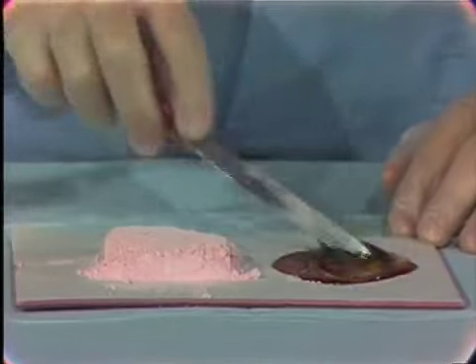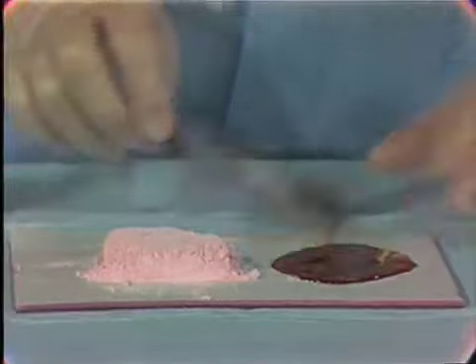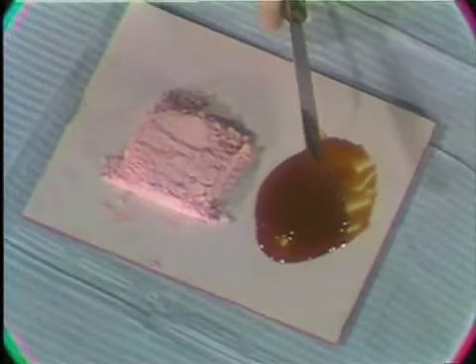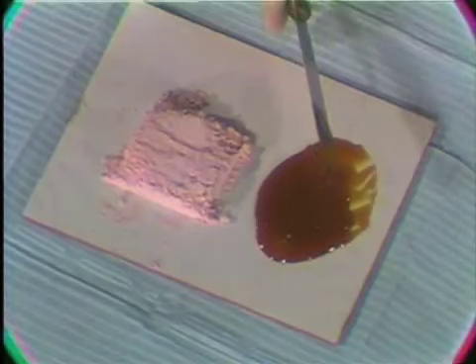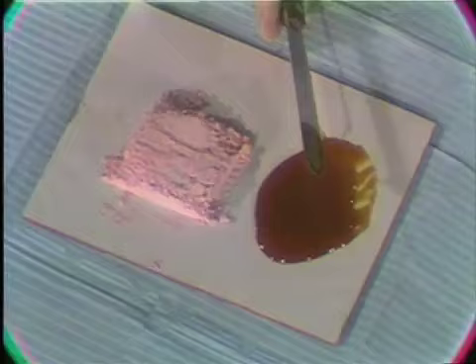You can put a little Vaseline on the lips of the patient so that when you get the mix properly, you load the tray and then immediately go over to the patient and place it in the patient's mouth.